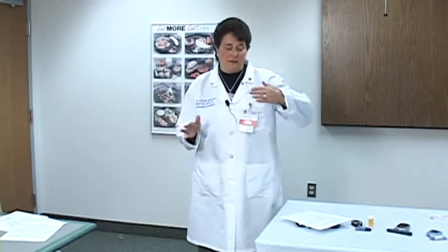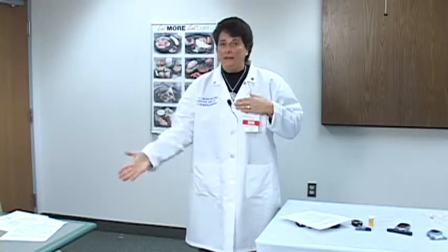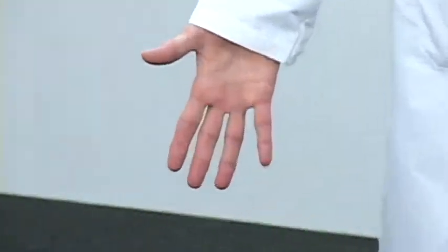Additionally, you want the blood to get to your fingertips. Your heart is here, and your fingertips are here. So if you hold it up, the blood drains from your fingertips. But if you put your hand down, watch and see how red my fingertips become, which means there's a lot of blood there.